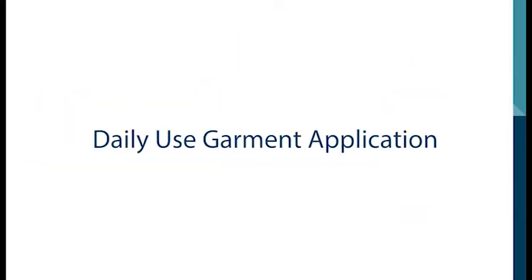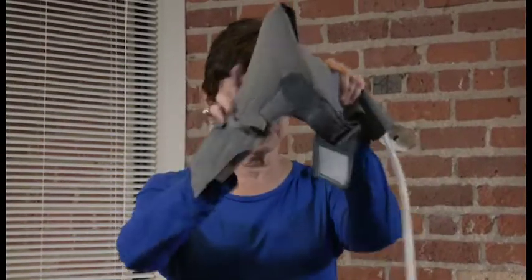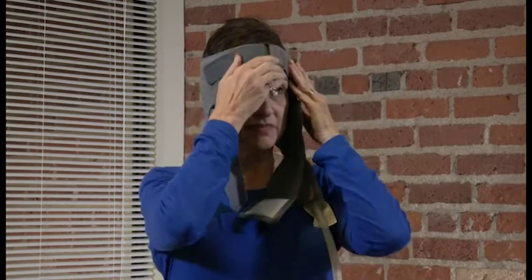To apply your garments for daily use, locate your head garment. Slide the garment on so the plastic D-ring is positioned across the front of your forehead.